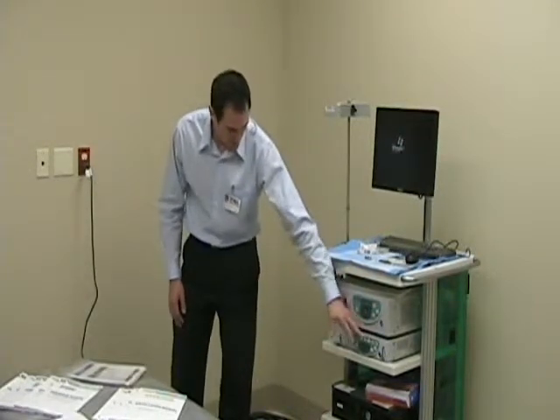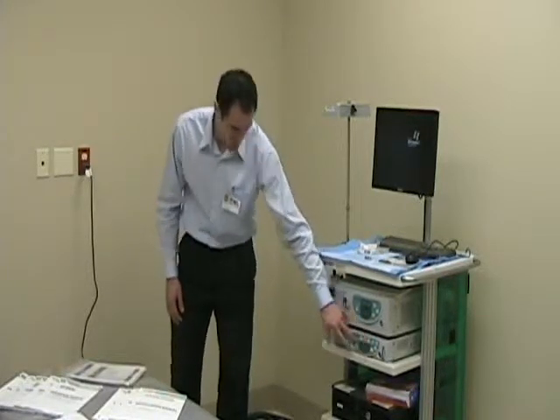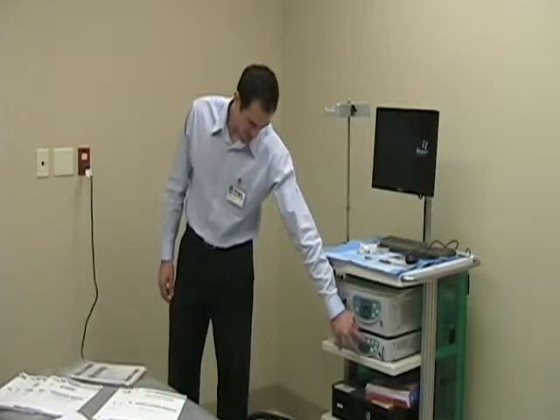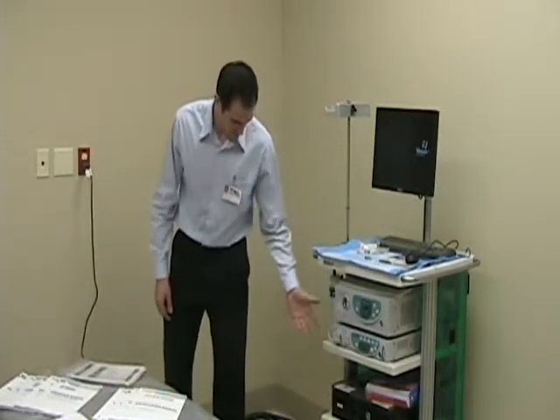Now to the processor. Pretty simple. There's a bunch of buttons on here. It might look complicated, but it's not. The only button you're going to touch is that standby. It's pretty much the only one you want to mess with. You start messing with the colors, displays, tones, iris, shutter, light source, you just get it all kinds of complicated. But anyways, that's pretty much it.